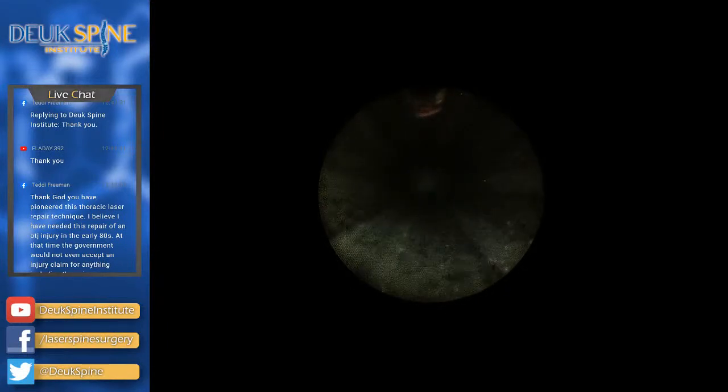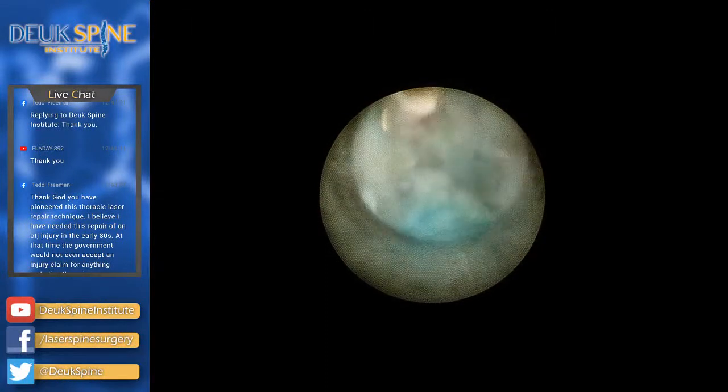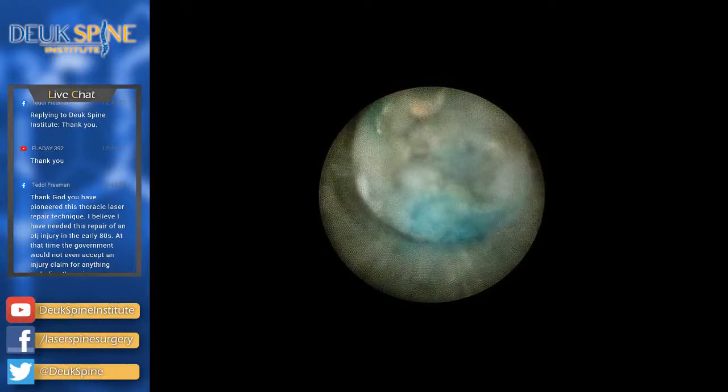So the problem I'm having here is I need a blue towel that goes down into the bag, okay, that carries the water from here down past this lip that's getting pushed together by my waist and blocking the flow of water into the bag. Does that make sense?